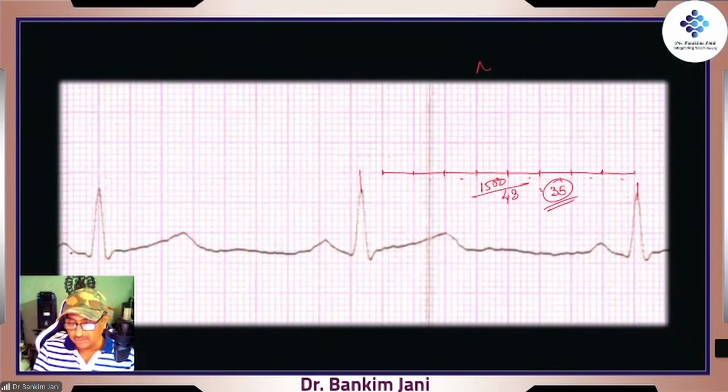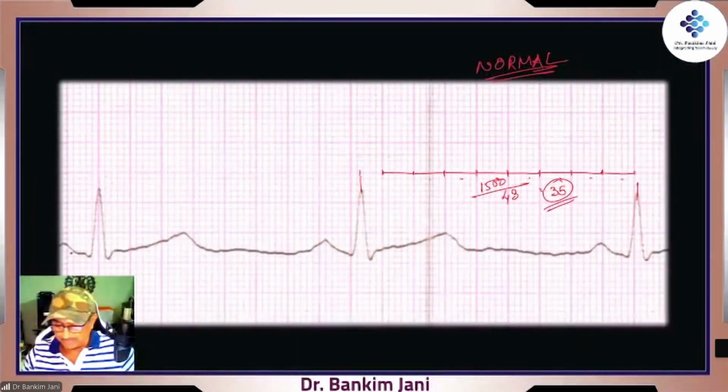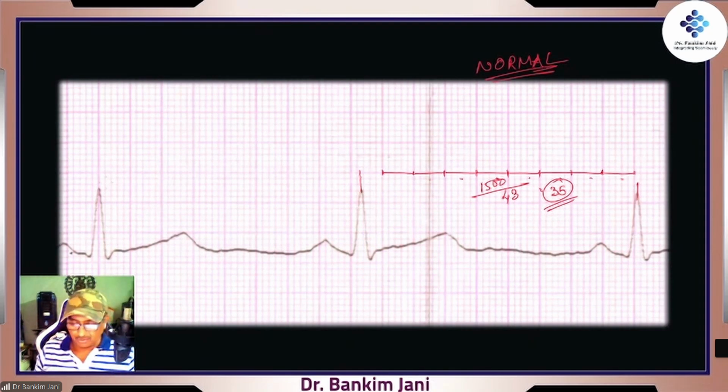So this is a normal patient. But a normal patient won't be having such a low heart rate. Such low heart rates are possible if you are into extreme athleticism and at total rest. Take the tennis player Bjorn Borg, right? He had a resting heart rate of about 36. But it is very difficult to take the heart rate to that low level. It is exceptional. Well, this is a normal patient.